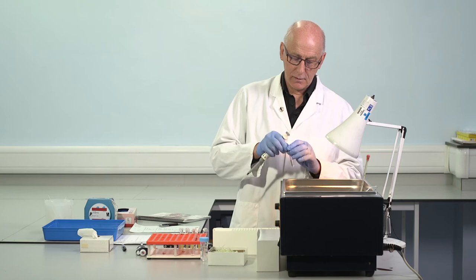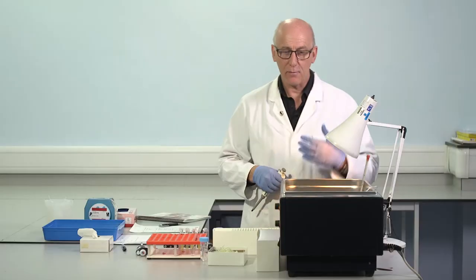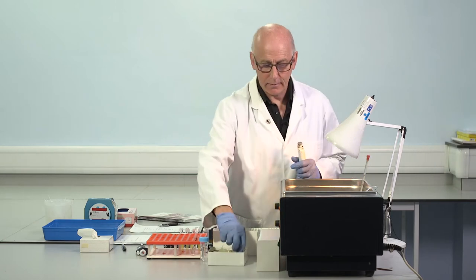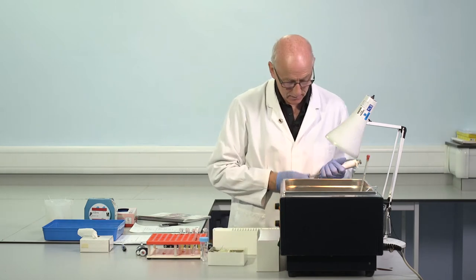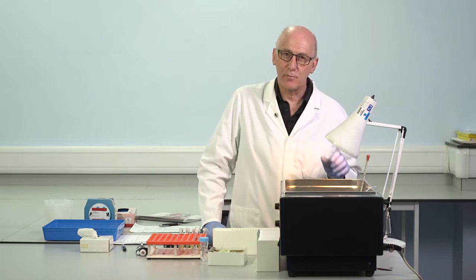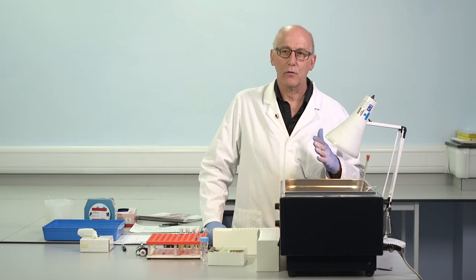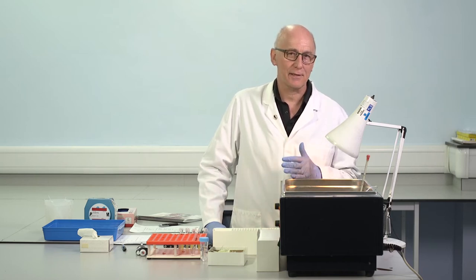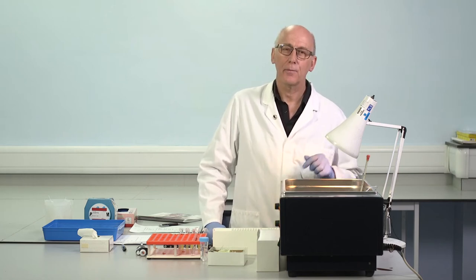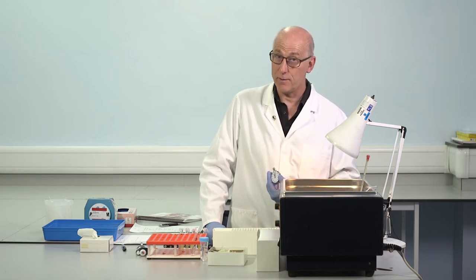So this contains activator, it contains phospholipid. At the moment, the activator, in this case silica, is beginning contact activation. So there are a series of reactions now occurring. This activation period has to be carefully controlled, carefully timed. Sometimes it's 2 minutes, sometimes it's 3 minutes, sometimes it's 10 minutes. It depends on the activator and reagent. This particular reagent is designed for a 3 minute activation. So we are carefully controlling 3 minutes.